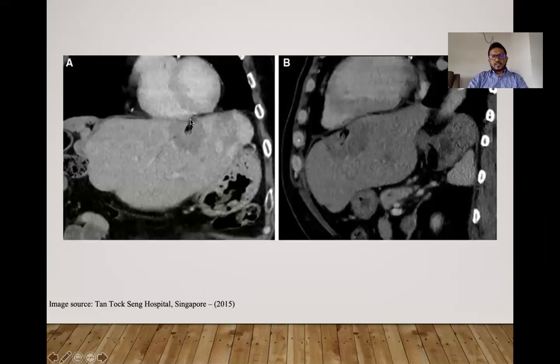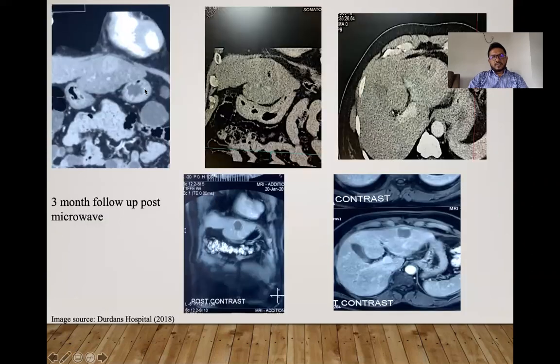This is another case touching the diaphragm, and there were no post-procedure complications. A similar case that we did in Colombo, where this lesion is touching the pericardium, was completely followed up, and there was no recurrence following a 3-month follow-up period.